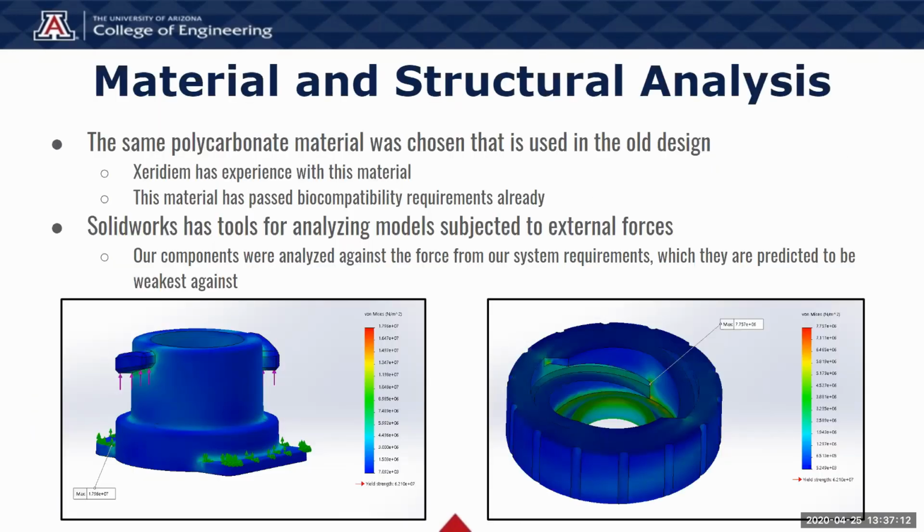The intended material for our system is polycarbonate. Ziridium has experience with the specific kind of polycarbonate and has found it to be durable, biocompatible, and it meets their shelf life requirements. Finite element analysis suggests the design and material will be more than adequate to pass strength requirements. SOLIDWORKS has tools for performing structural analysis, which were used to ensure structural integrity when the assembly is pulled on axially. This case was chosen as it is expected to be the system's weakest direction.